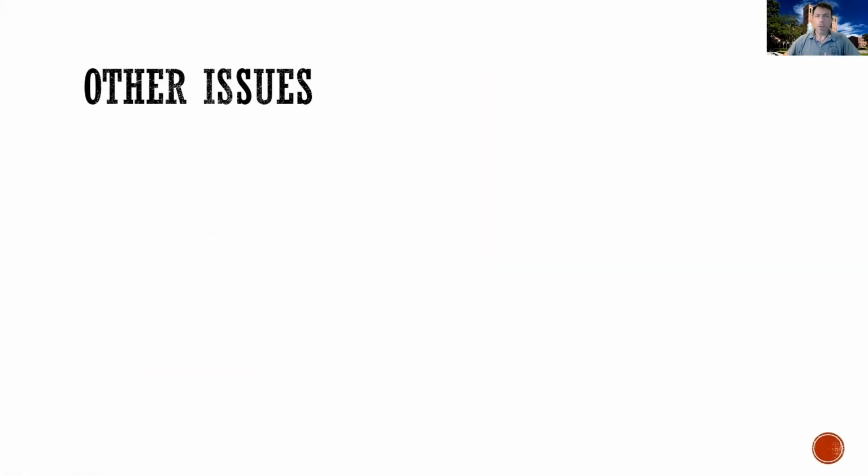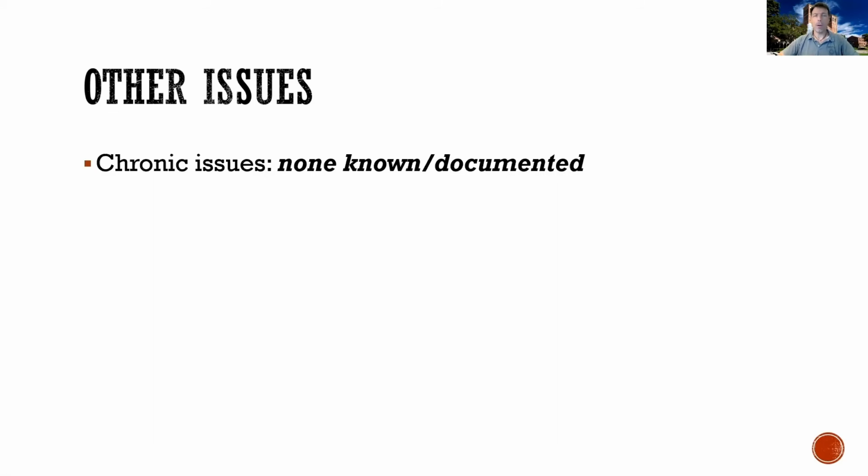So finally, overall, as I said at the beginning of this presentation, there are no known chronic issues, in the sense that nobody has ever shown that undergoing multiple MRIs over time is associated with any chronic issue. Now, in fairness, MRI has now been around for some 30, 35 years, so I would imagine that if there were long-term issues, some might start manifesting themselves. So overall, it is generally believed that MRI is safe, in the sense undergoing one or more MRIs doesn't seem to be associated with any negative event or outcome.